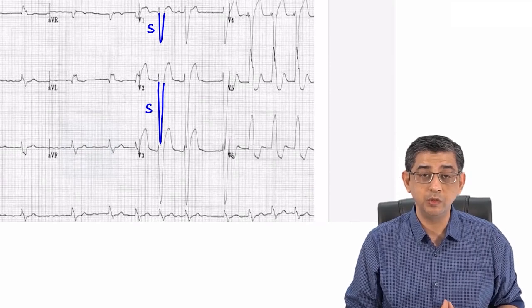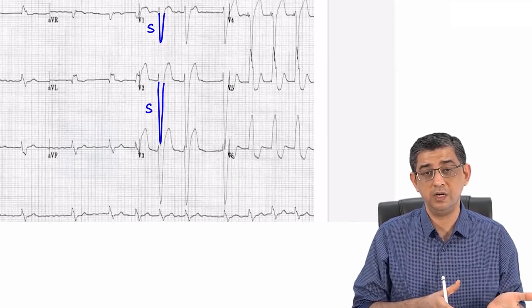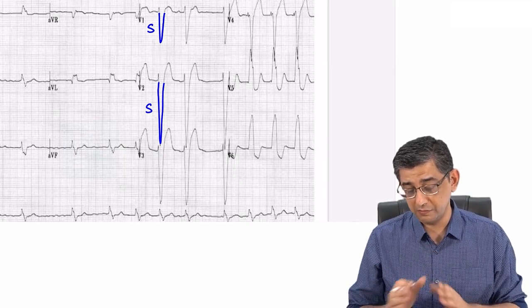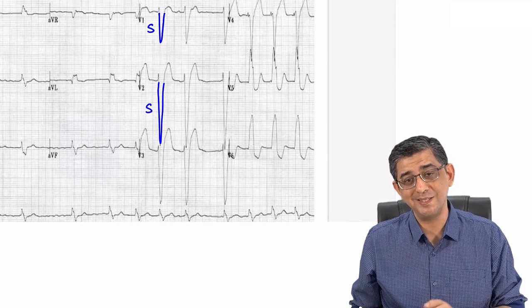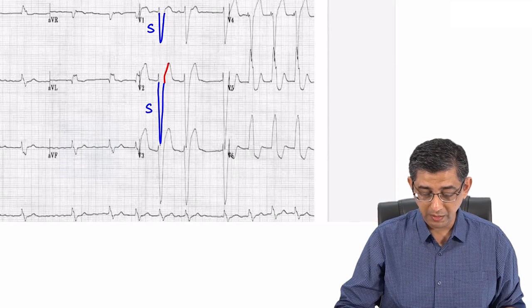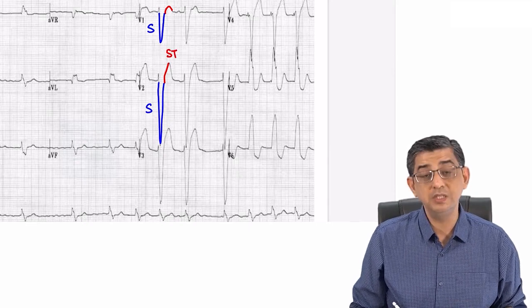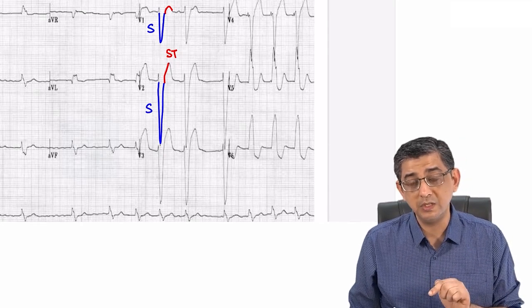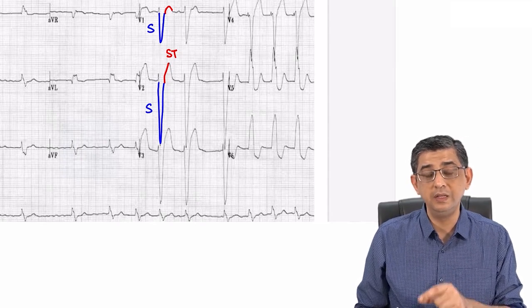And the surprising thing about why these ST segment changes come is that, again, depolarization of the heart is defective, so repolarization abnormalities will also be seen. We will always find that in any person who has this left bundle branch block where the S is relatively deep, the ST segment will be relatively going up. I have currently highlighted a magnitude of ST elevation. You need to remember that the ST changes that occur in bundle branch block are opposite. That's the word. The ST segment changes that occur in bundle branch block are actually opposite to the predominant vector in the lead per se.